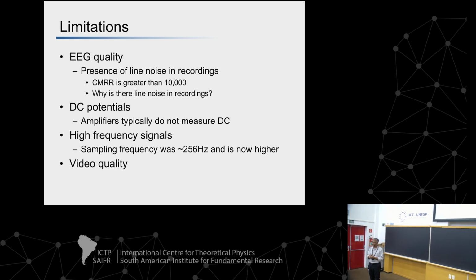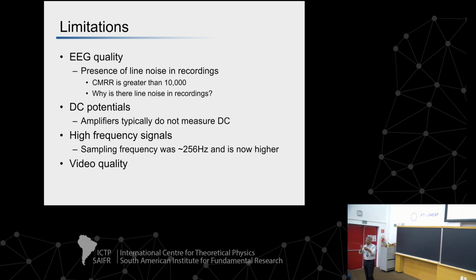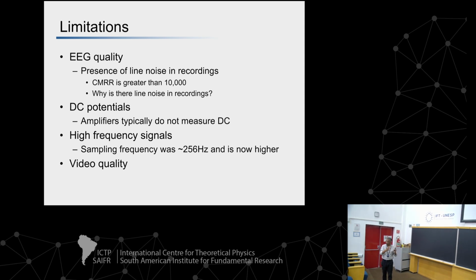Do you acquire much more information by increasing so much the frequency of the sampling? Because 256, when you go to analyze, it's pretty high already. Correct. Traditional clinical analysis, 256 hertz would have been fine, but in the last decade or more, there's been interest in high-frequency oscillations in the ripple band and the fast ripple band. In order to capture them, I think you have to sample at least about 2 kilohertz. And that's why, for us, we go at 4 kilohertz, just a little bit oversampled.